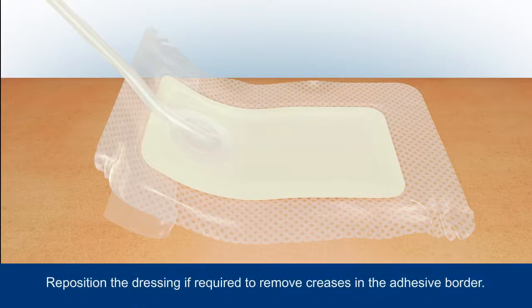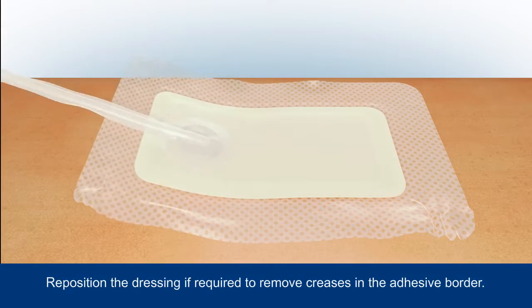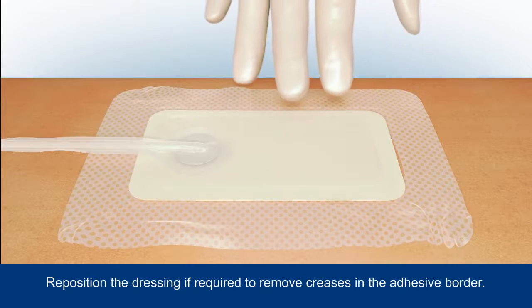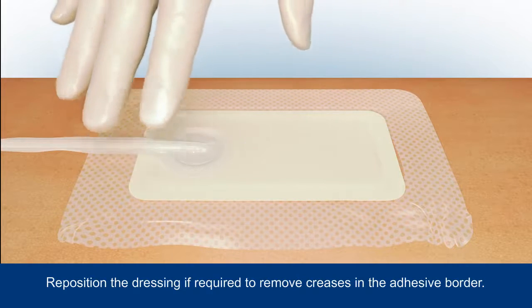Remove the remainder of the backing and carefully smooth the dressing borders around the wound, securing it in place. Avoid creasing the adhesive border, but if this happens, simply reposition if required.